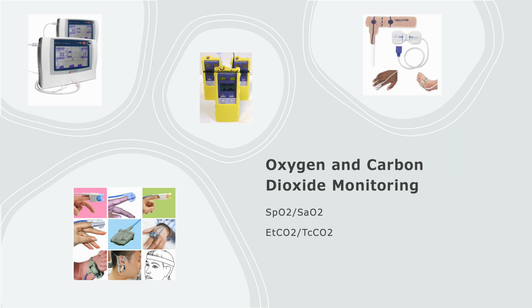The finger probes come in all sorts of styles, and it just depends on what kind of equipment your lab uses as to what probe you can use. A couple big names of brands are Masimo and Nonin. Respironics was also in on it, but they got out of sleep. They might still be getting some respiratory products out, though. And here's some of the examples.